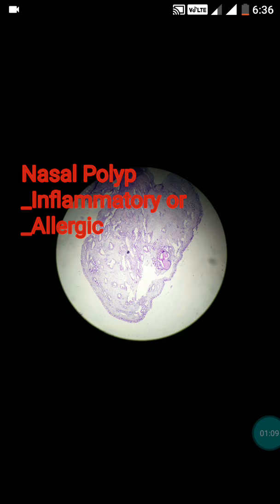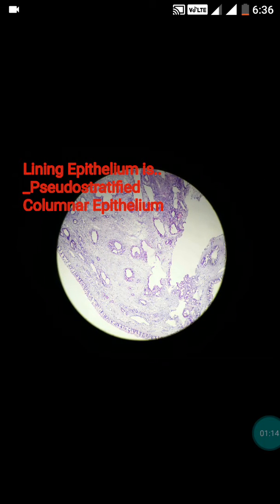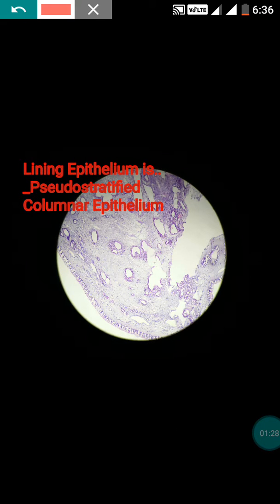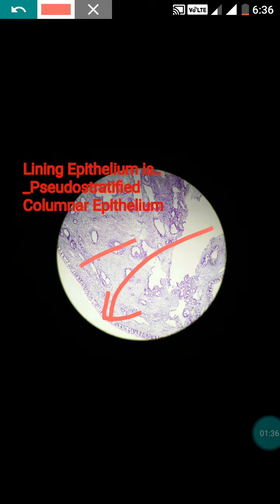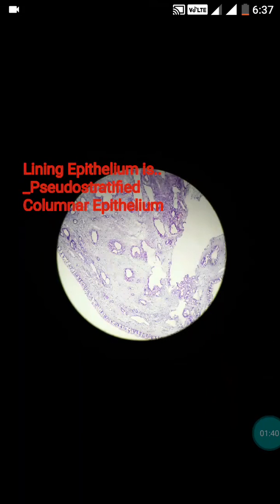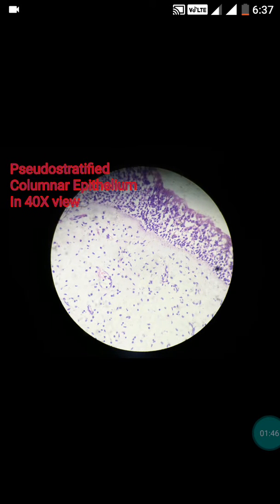Our case was a simple inflammatory nasal polyp. Any polyp is made up of a lining epithelium derived from the parent organ. Since this is a nasal polyp, the lining epithelium is obviously pseudo-stratified columnar epithelium. Let's now inspect this epithelium in the high power view.